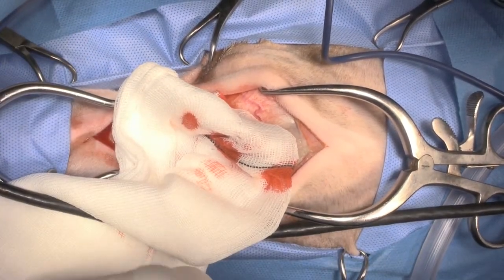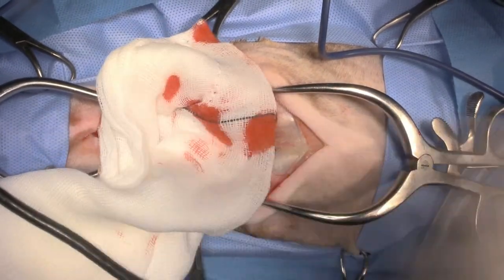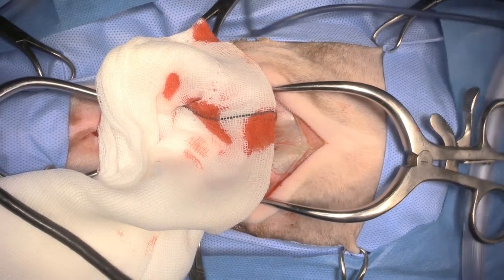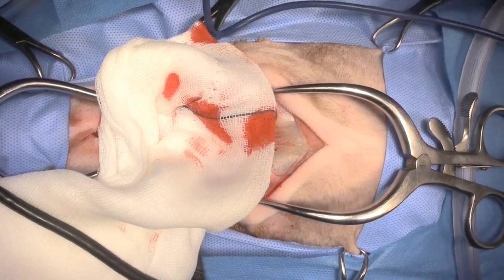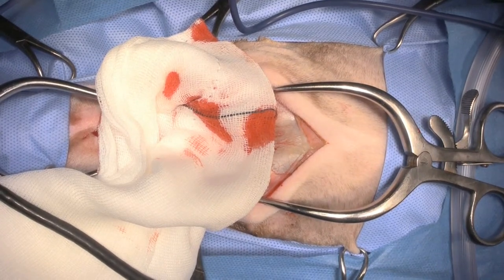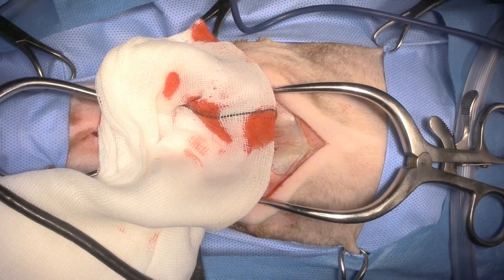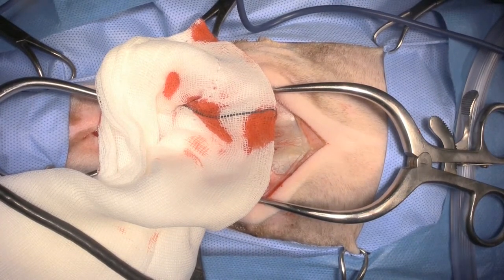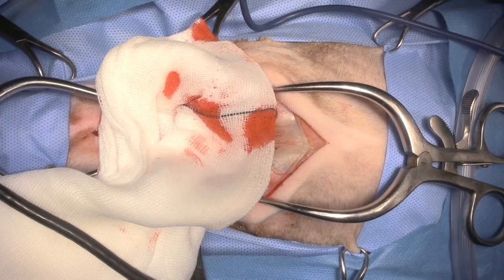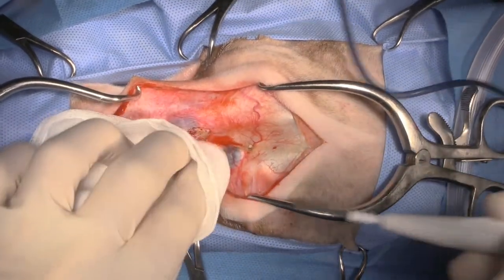Had a big weekend this weekend with neuro cases and stuff, and then also happened to have our main central supply person on annual leave. So it's been difficult to keep up with all of the surgical instruments. Can you get me a burr, a number 5 or 5 mil Sumex burr, please?